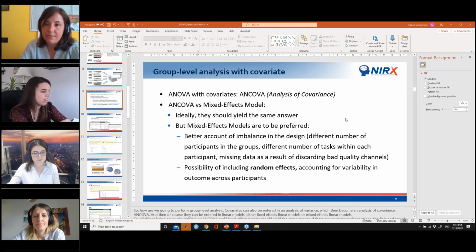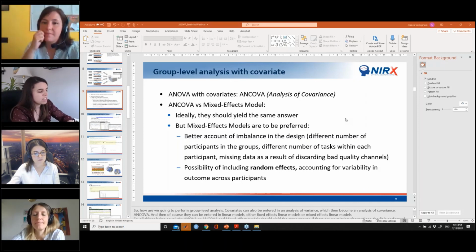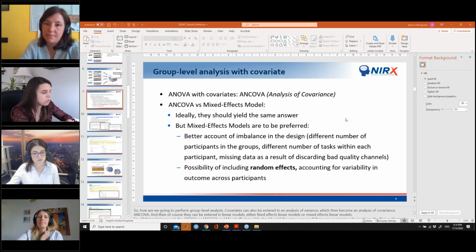Okay, and we've got our last question here. It's a bit of a long setup, but it's all very clear. If a study is looking for the specific effects of aging, is it necessary to add age as a regressor when the group selection is already based on age? The age range may be as wide as 20 years, the 2 groups being 20 to 40 and 60 to 80. Although this question is not exactly related to second level analysis, in the same study, should DPF or PPF be adjusted for the group?